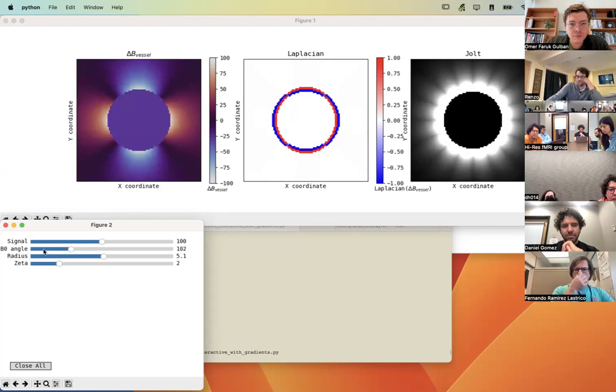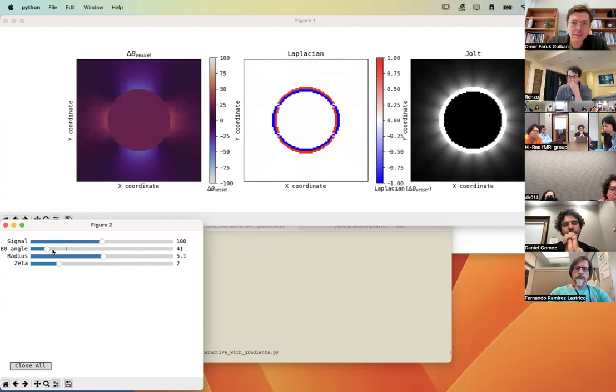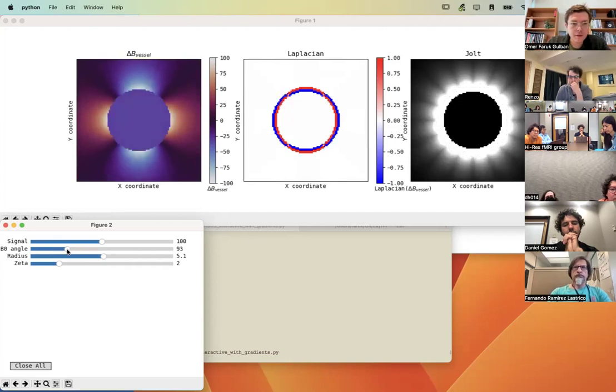So, okay, what do we understand from it? Well, if you measure a change in Laplacian, it might come from a vein changing its orientation in a task versus rest. Of course, this is a nonsensical scenario, but it can yield Laplacian changes, okay? How else can we affect a Laplacian that is measured in, let's say, this small square area?